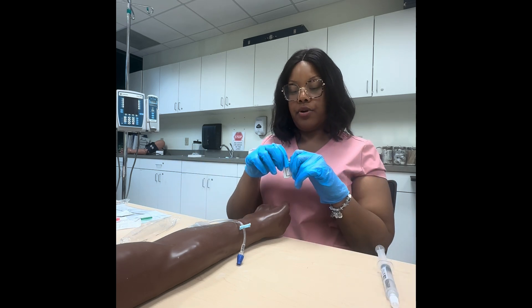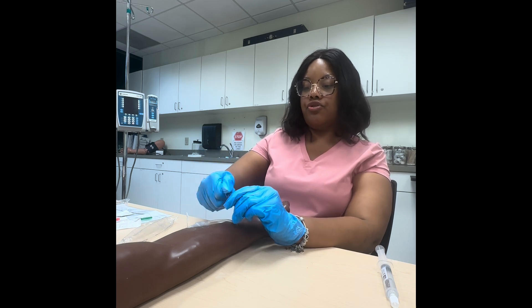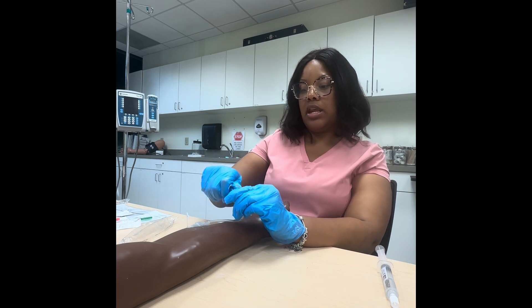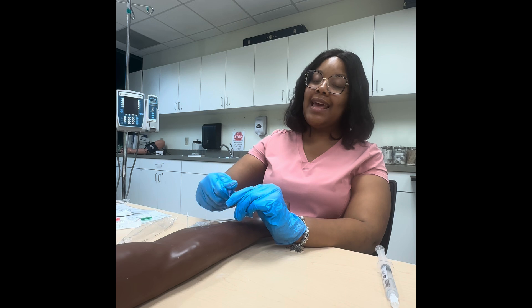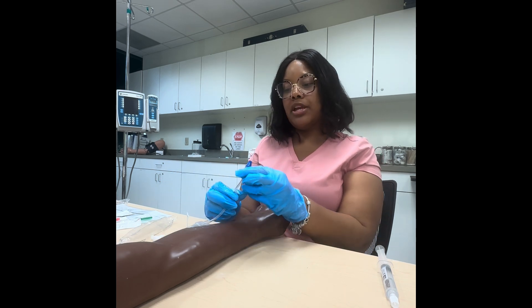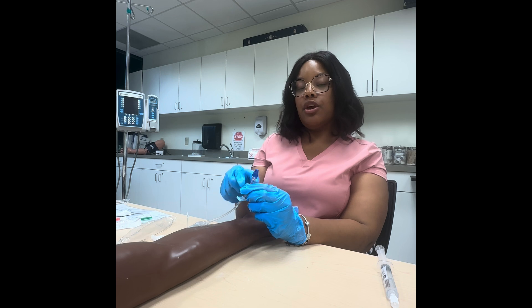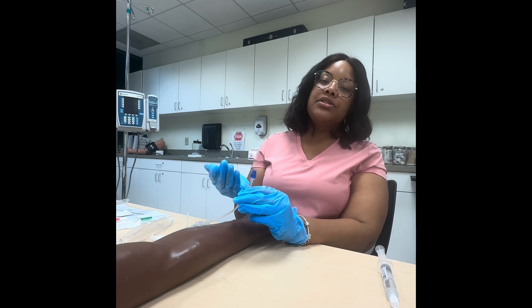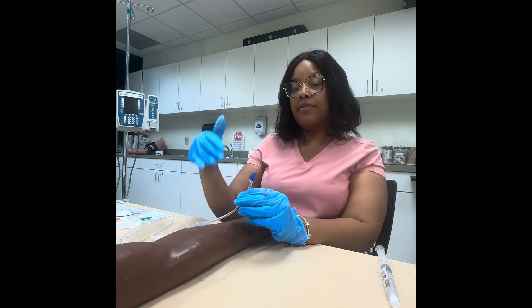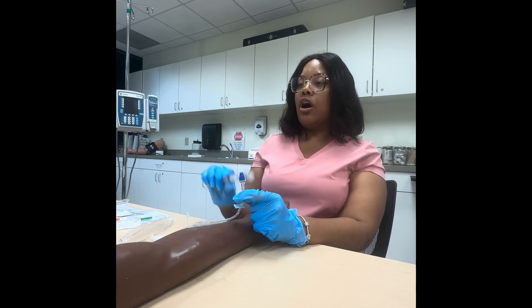We're going to alcohol wipe this hub and scrub it for about 15 seconds to make sure we remove any bacteria, since this didn't have a cap on it — we'll talk about caps later. Also make sure the clamp is on the open side, because if it's on the tightened side we won't be able to use the IV. That clamp is there to prevent backflow of blood coming out of the vein into the line.